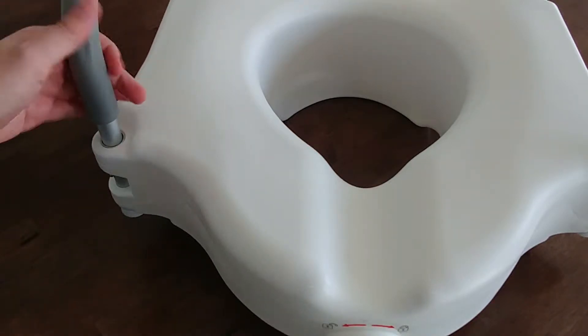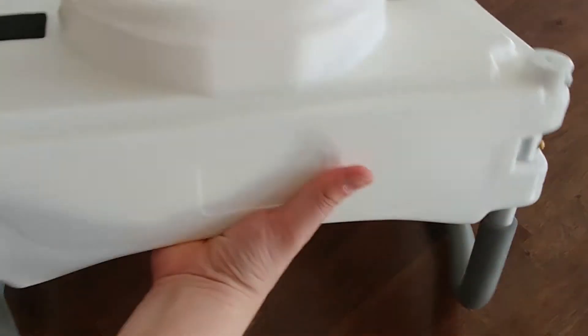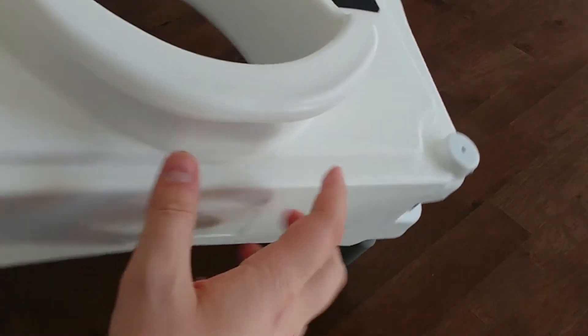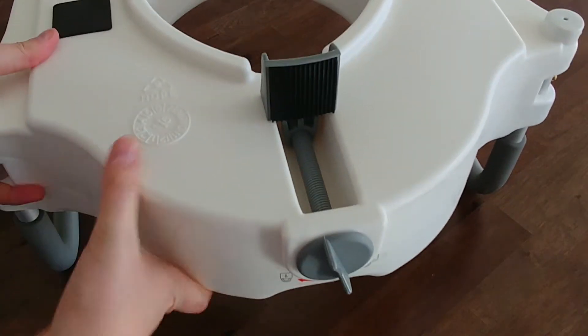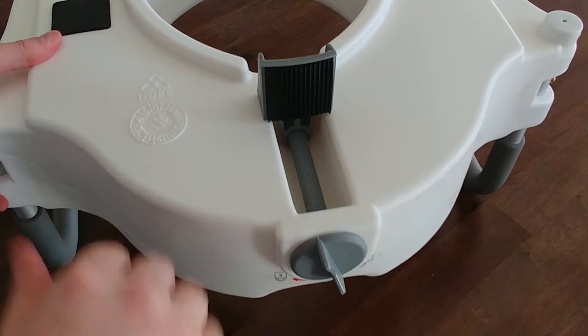I'm gonna put together a quick video on the Waze toilet seat. Start turning it over. To start with, this lip here in the back will go underneath the back rim of the toilet bowl. The clamp here in front will attach to the inside edge of the front of the toilet bowl.